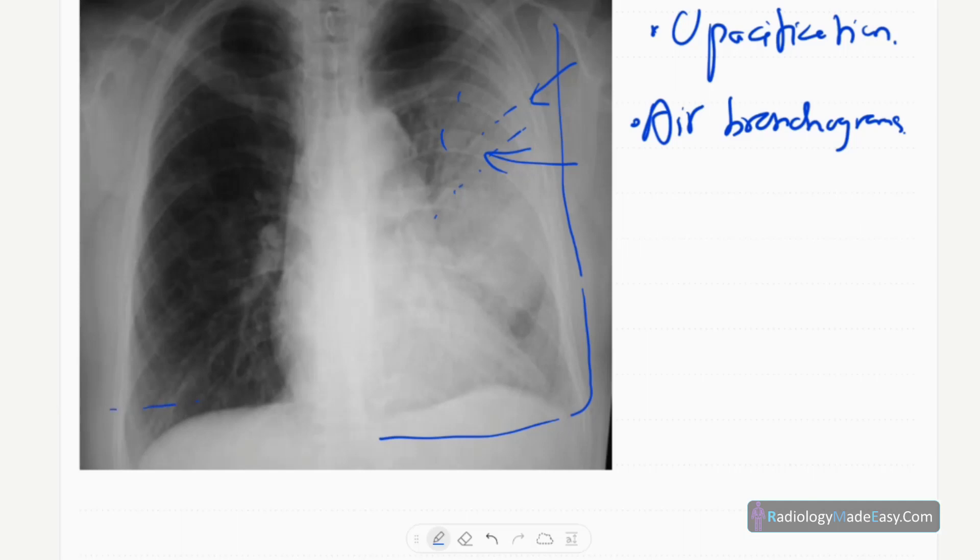Both diaphragms are at the same level. No pleural effusions, no cavity formations, no complicating features, no hilar masses. Right lung is normal, no effusion, no pneumothorax. Underlying bones are also normal.